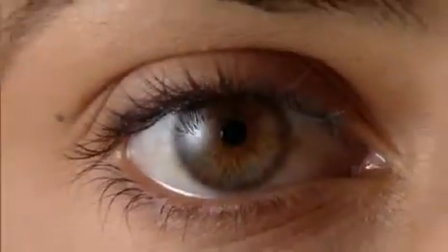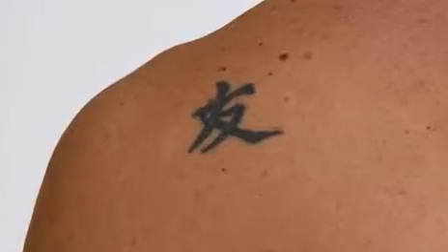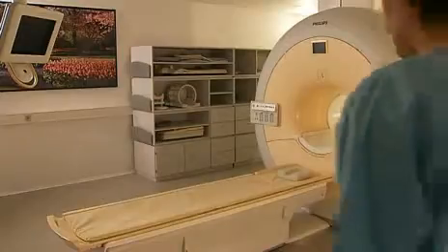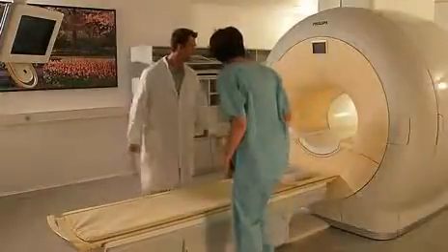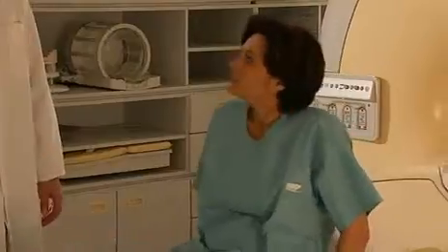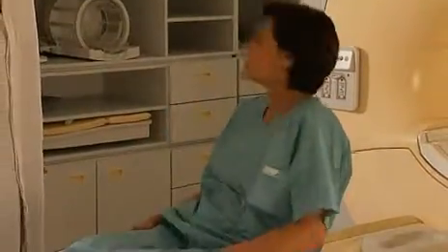Even makeup and tattoos can contain ferromagnetic material. Remove all makeup and be alert to the possibility of irritation in tattoos. Ensure that patients wear hospital gowns without metallic fasteners. Patients' ordinary clothing can contain magnetic objects or threads that may pose a hazard in the MR environment.